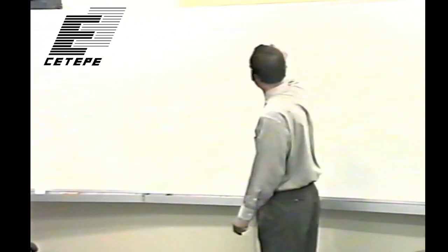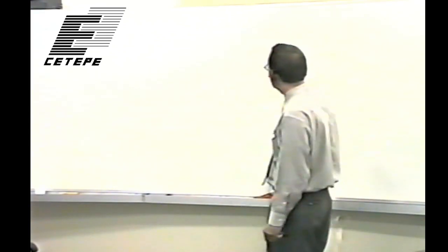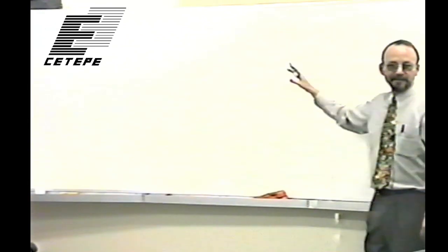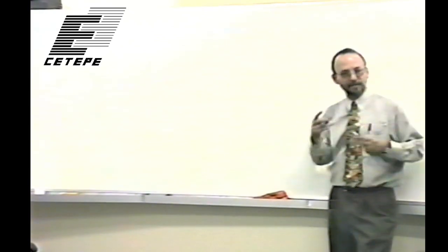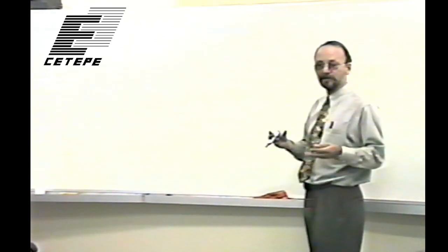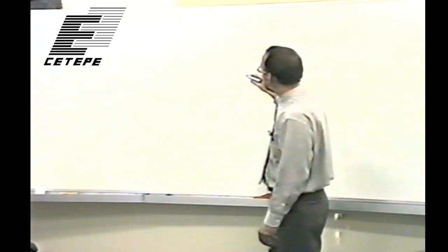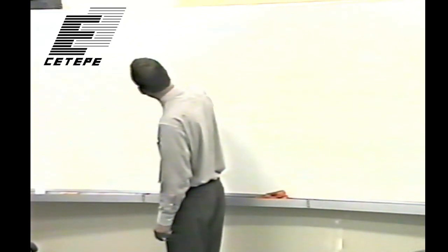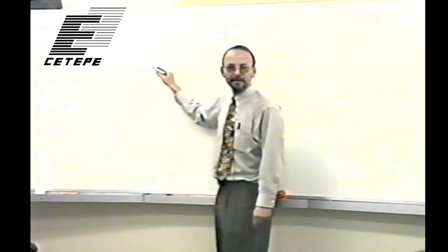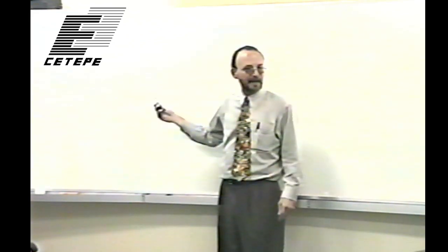So if we had a body with blood vessels in it, and we wanted to image the vasculature, okay? And so we were able to inject iodine into the bloodstream. So we'd have a low but significant concentration of iodine in the blood. And if we were able to take one image with a monochromatic spectrum at an energy just above the K edge of iodine, we would get very heavy absorption of these X-rays by the iodine.